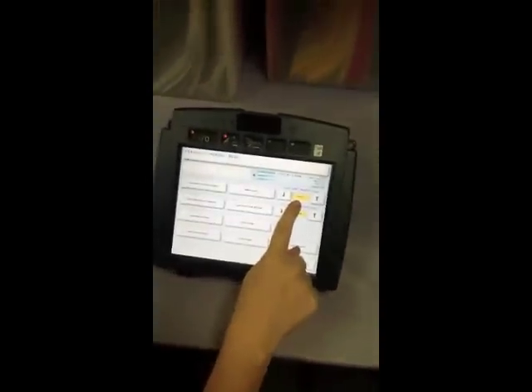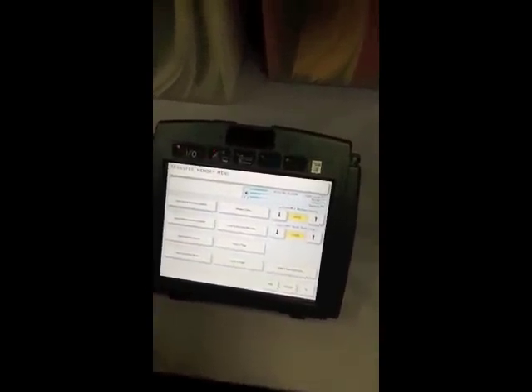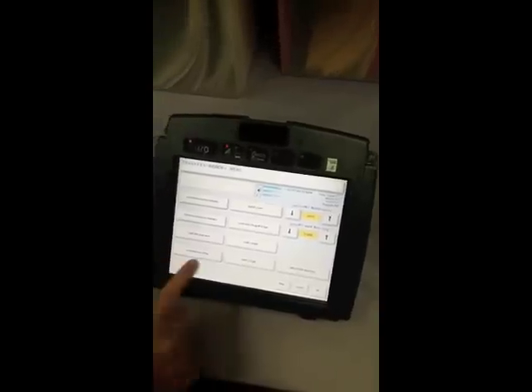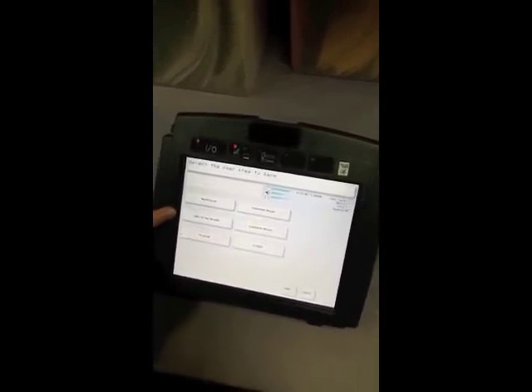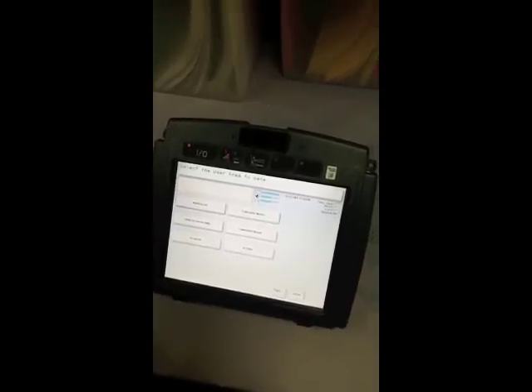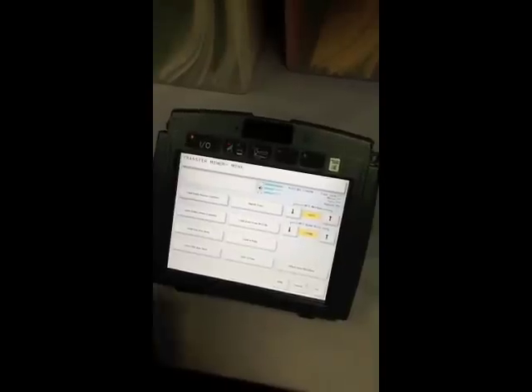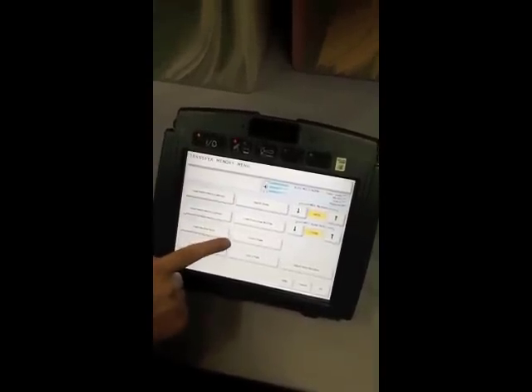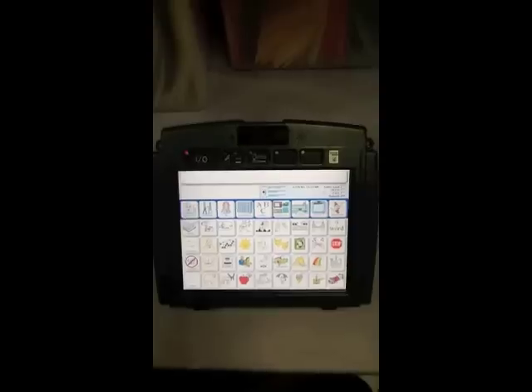If the auto option is not already set for the MTI method, select that now. Then select Save One User Area and select the area you want to save. If not already done, you will type in a name for the MTI file. You will know the area has been saved when a dialog box appears to tell you when the transfer has been completed. You have the option to load and save an icon, a page, the user area, or the entire device onto your flash drive.